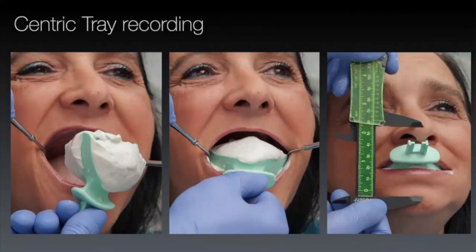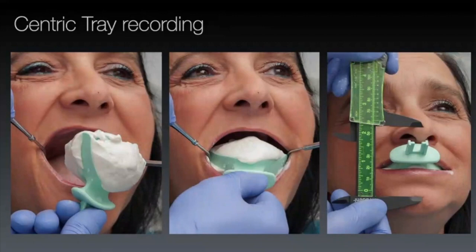The most accurate way I've found is to get a patient to hum. When you hum, your teeth are around three millimeters apart — pretty much everyone hums in the same position. So if we know that, we use the centric tray to get that measurement: dot on the nose, dot on the chin, patient hums, and we measure.